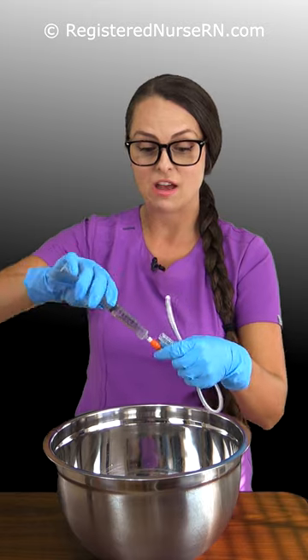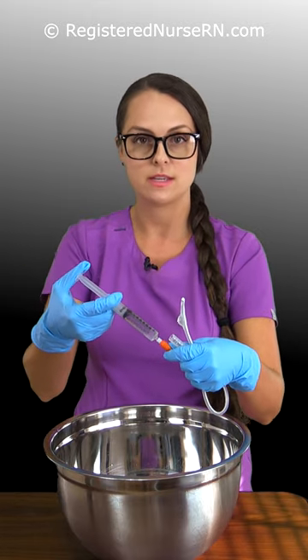Safety first. Here I have a Foley — it is a 5cc balloon — so I'm going to start out injecting 10cc of water in it. This should be easy cheesy.